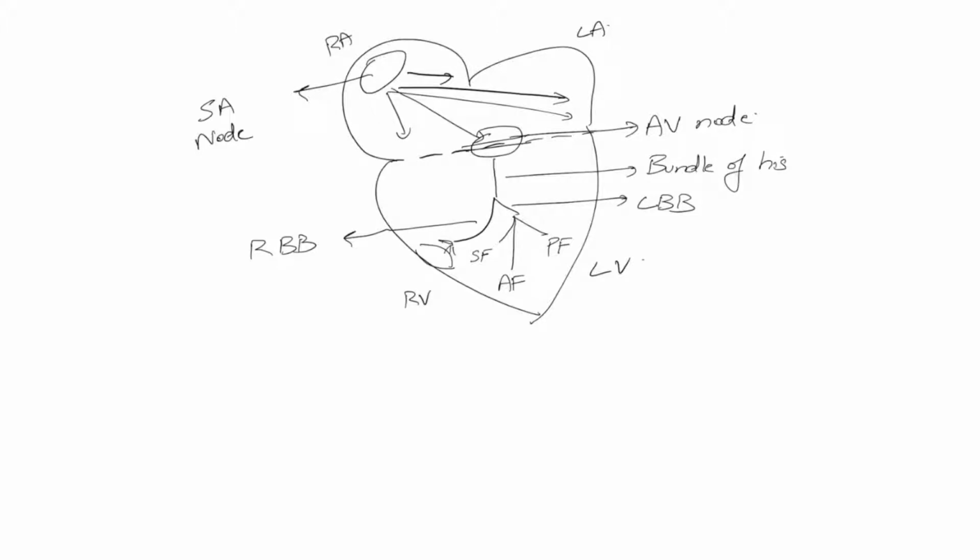If there were a magical way in which most of us could actually see the flow of electricity in the heart, that would be awesome. The problem is doing it at scale where every physician can do it can often be very difficult. So, an alternative would be taking these signals that are passing through the heart and transcribing them onto a piece of paper so you can actually see the flow of electricity. And let's explore how that's done.